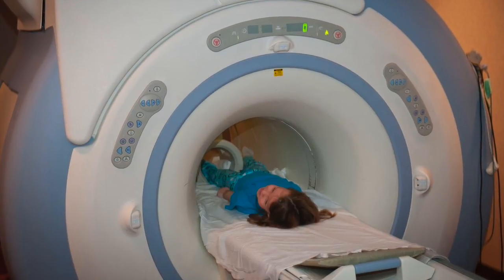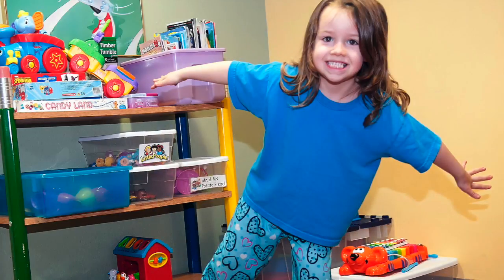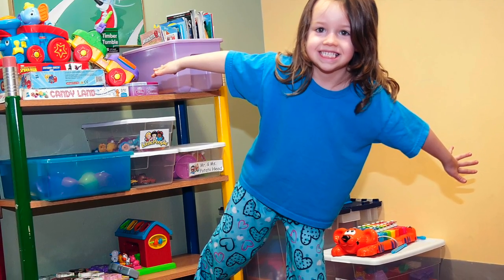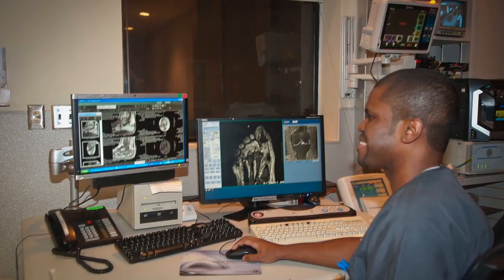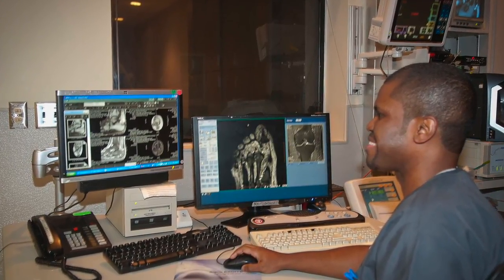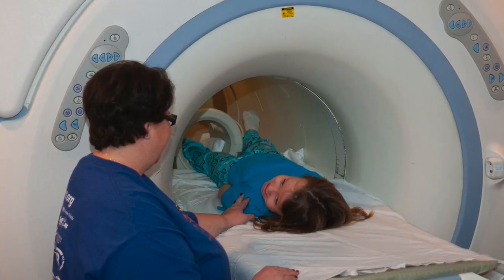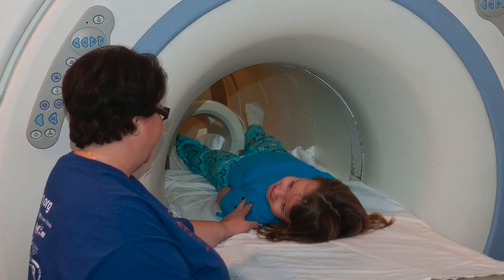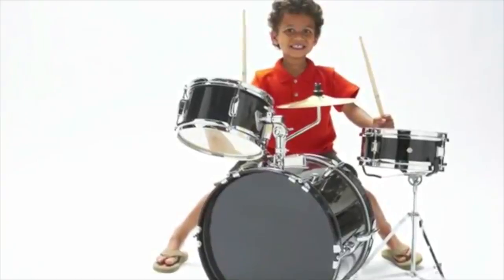The most important thing you need to remember is to be very still while you get your pictures taken. It will take about an hour to finish your pictures. So before you get on the MRI bed, make sure you jump up and down and get all the wiggles out. The person taking your pictures will help you onto the MRI bed and will be able to hear you and talk to you the whole time to make sure you're comfortable. Once the camera is turned on and gets really noisy, you might think it sounds like someone's playing the drums. That's how you know it's taking really good pictures and you're doing a great job.